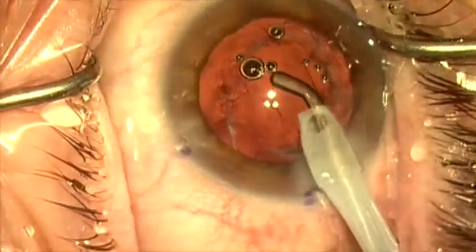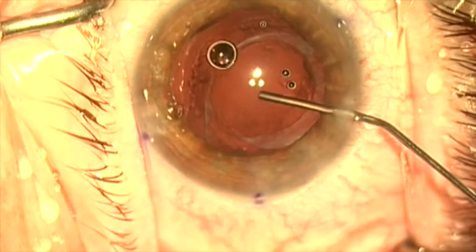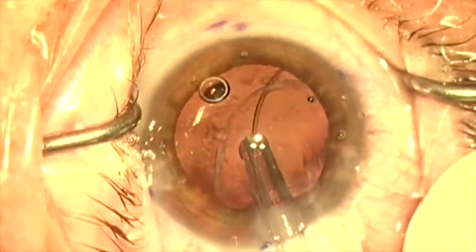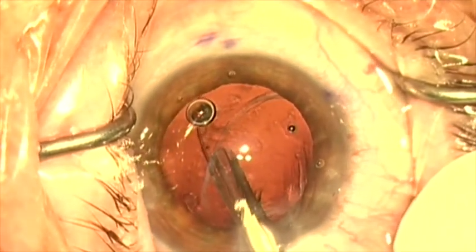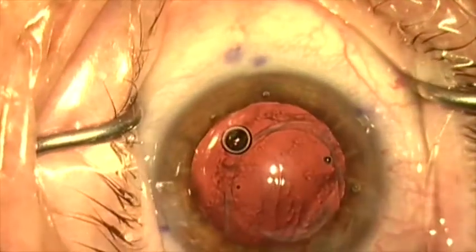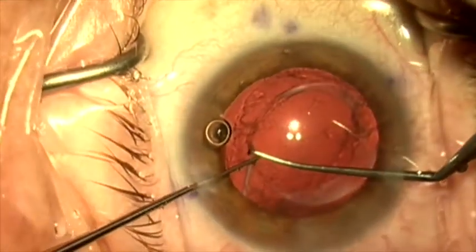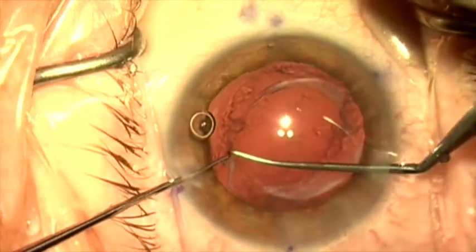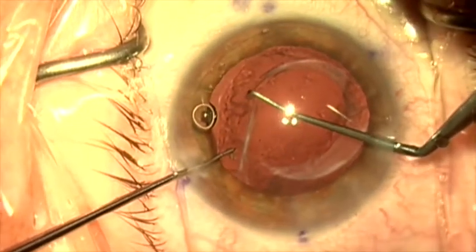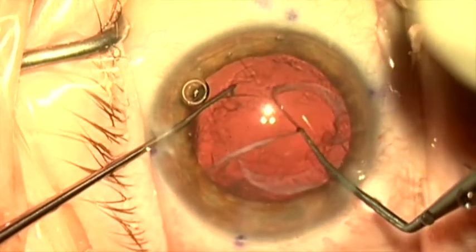Viscoelastic will now be placed to reinflate the capsular bag, and a capsule tension ring is going to be injected into the bag. It's very important to make sure that you've dissected all the way out to the equator before you inject the capsule tension ring. Once the capsule tension ring is placed, I want to remove some of this fibrosis on the anterior capsule because I think it's decentering the anterior capsule rim a bit and causing some contraction. We're going to use a bimanual approach and peel this fibrosis as much as possible off the anterior capsule rim to freshen it up.